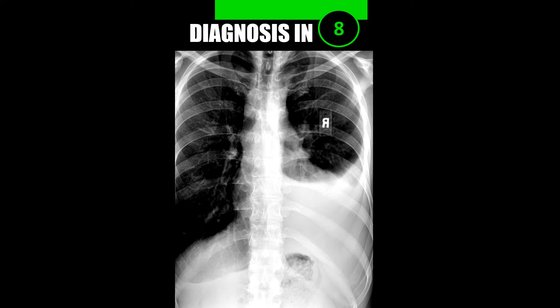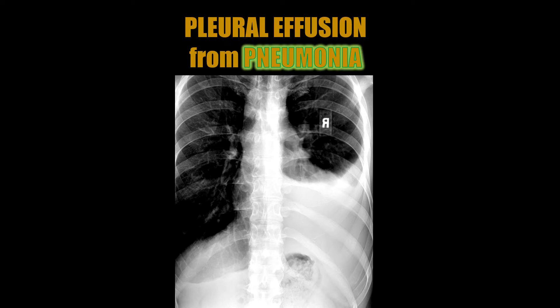Case number four: this is a good example of pleural effusion — in this case from pneumonia. There's blunting of the costophrenic and cardiophrenic angles, and this entire shaded region represents the fluid accumulation from the pneumonia. Compare the involved right side to the normal left hemidiaphragm and you should be able to see the abnormality.